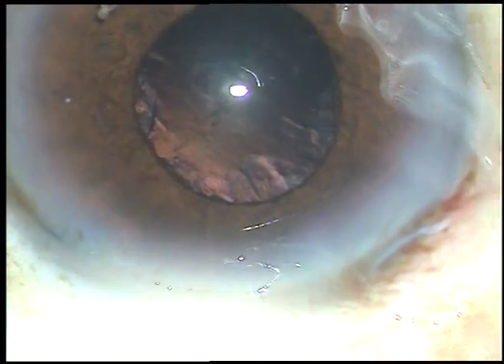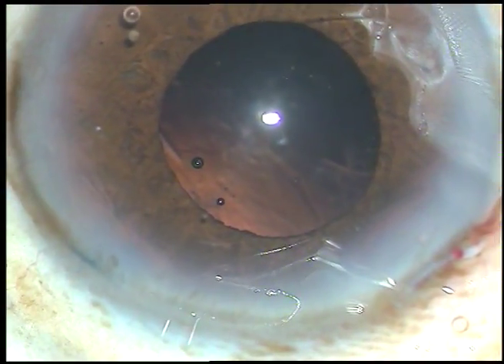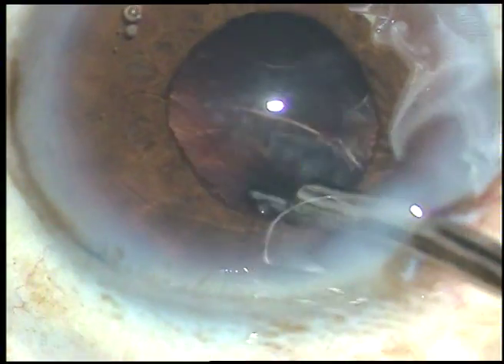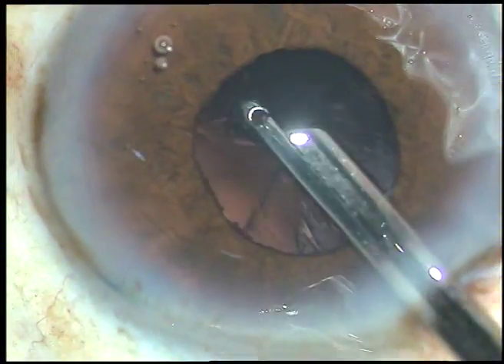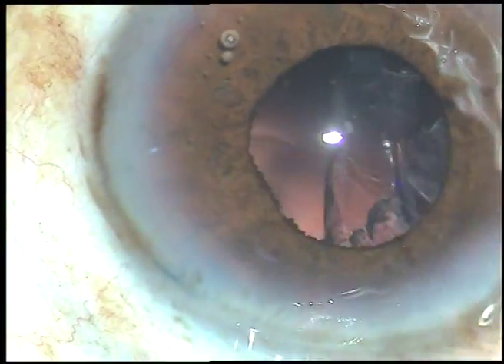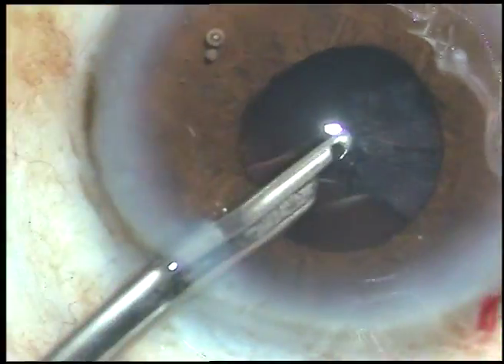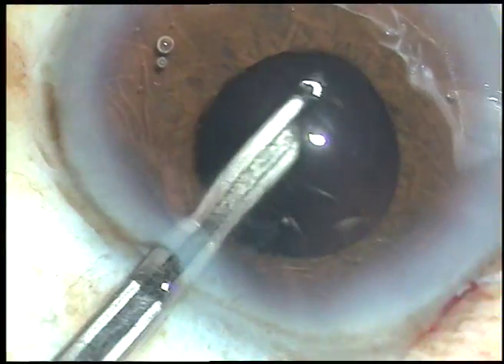The nucleus is removed. Now viscoelastic substance is injected into the anterior chamber, and now I have to use some device to remove the cortical matter. Since I made only one side port, I am using a Simcoe cannula. I am going under the iris, catching hold of the cortex, pulling it towards the center and removing it. Going through the side port now and removing the rest of the cortical matter.